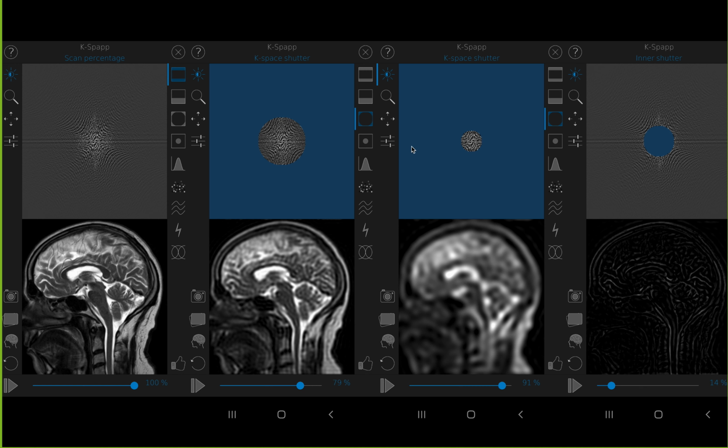So these kind of simulations tell us that the size of K-space determines the resolution. And the inverse can be seen here. When we remove the inner part of K-space, we basically only have the high spatial frequencies without having the low resolution. So by manipulating different weights in K-space or K-space sizes, we are basically playing around with the spatial resolution.